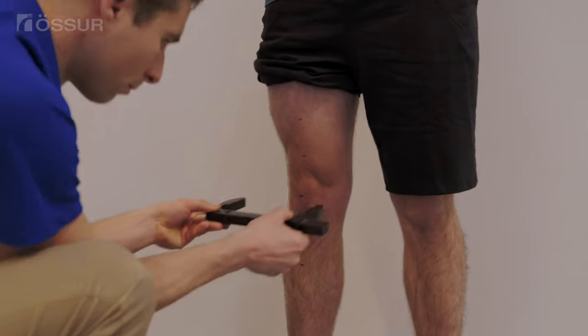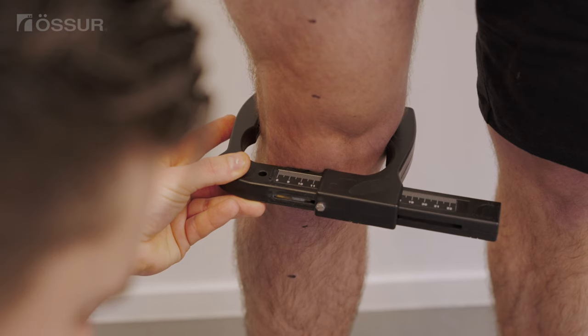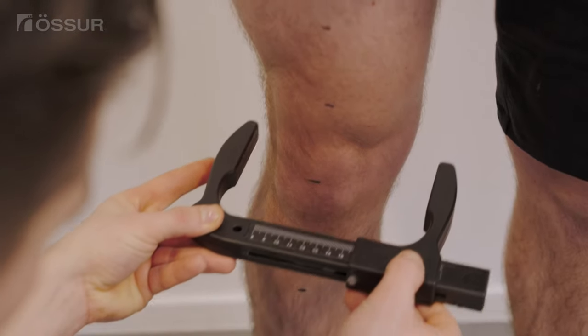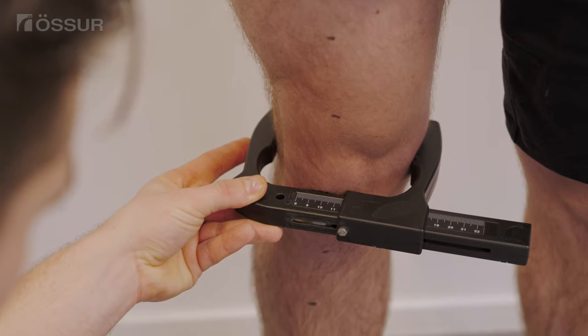Position the contact force caliper with the bottom edge on the joint line to capture the measurement at the knee axis, approximately ¾ of an inch above the joint line. Be as accurate as possible as this will set the hinge width. We recommend double checking the measurement at least one time.